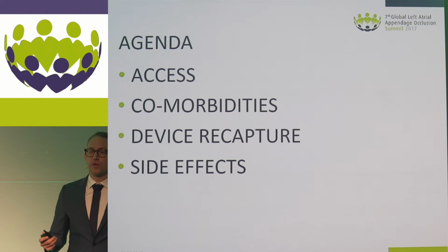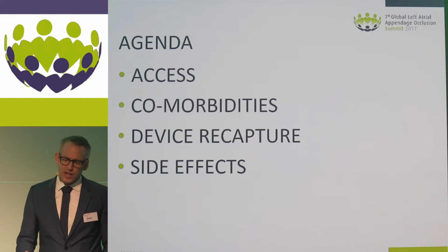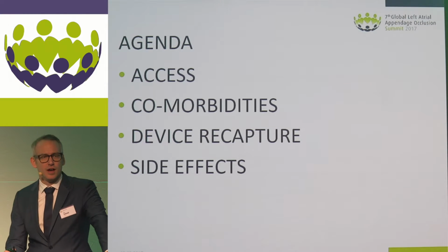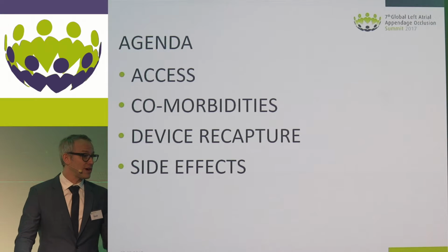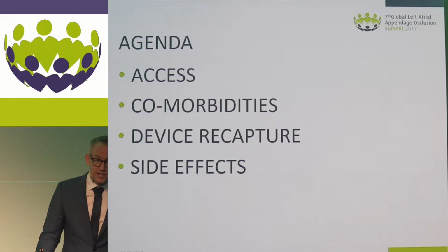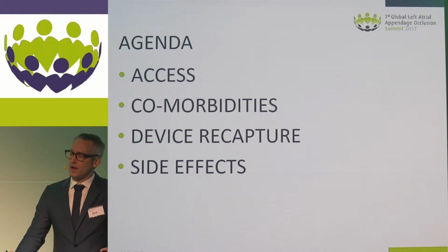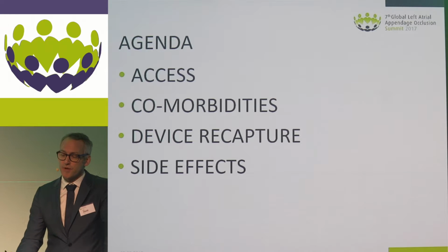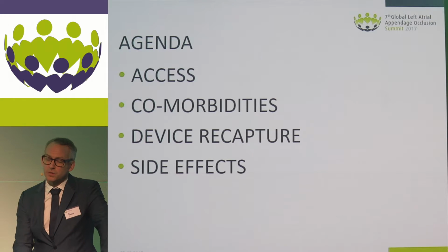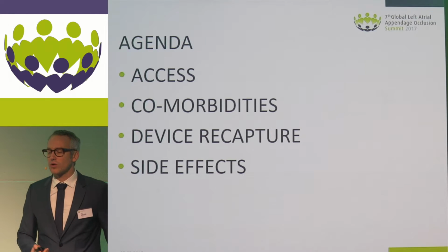Let's continue with patients with comorbidities. I think as we saw this morning, many of our patients have various comorbidities, and sometimes this puzzles us to apply a large load of contrast media in order to avoid pulmonary edema. Some of them are allergic to contrast media. Hyperthyroidism plays a role, and of course, contrast media-induced nephropathy may occur. That's why we developed a strategy to exclusively guide the procedure with echocardiography.